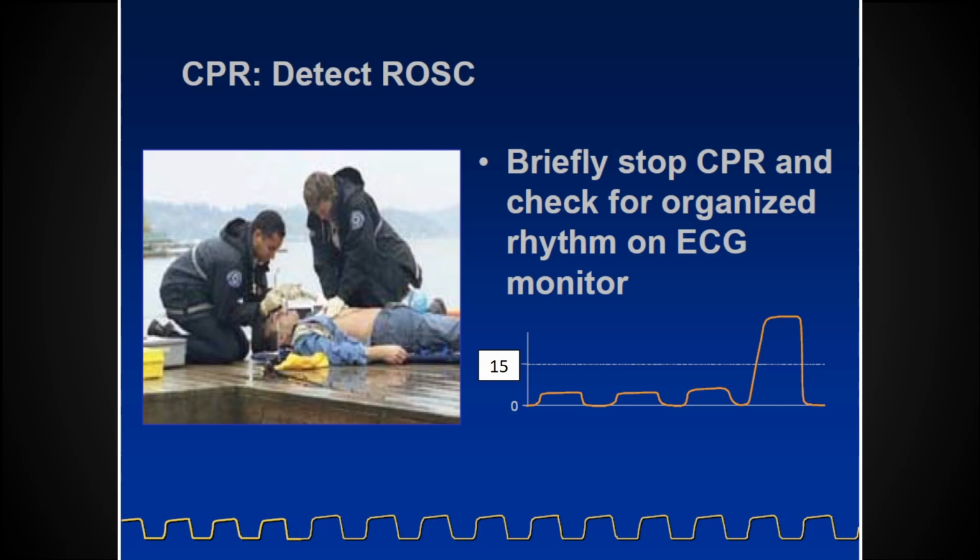Why? What's happening here? Let's assume that your iGel was good, that your CPR was good, that everything you were doing is textbook, and then all of a sudden, this happens. What is this showing me? Metabolism, cellular metabolism. Right? It's showing me that there's end tidal coming out of his mouth. What is the end tidal measuring? CO2. Where is the CO2 coming from? His mouth, his trachea, his lungs, his blood. His blood is going back to his tissues.